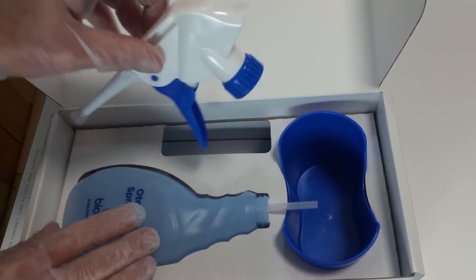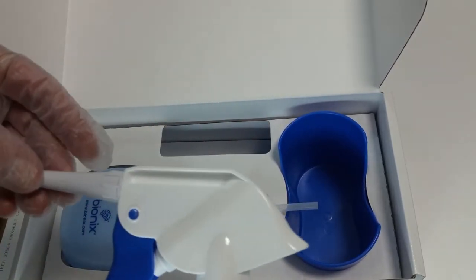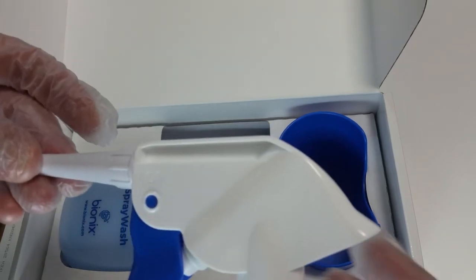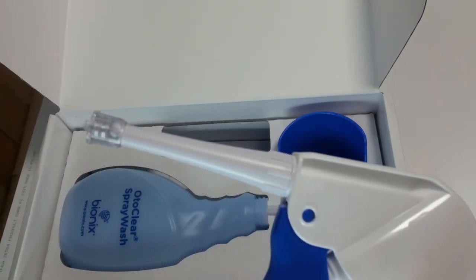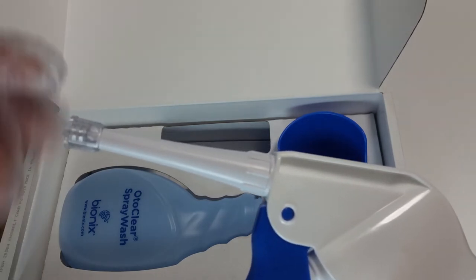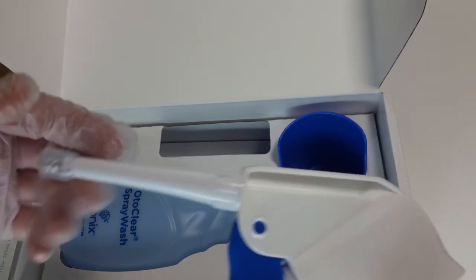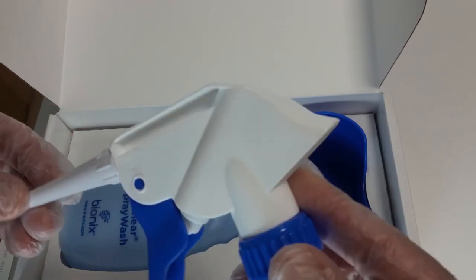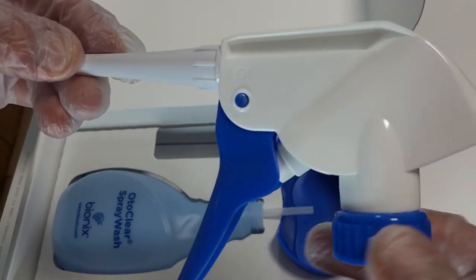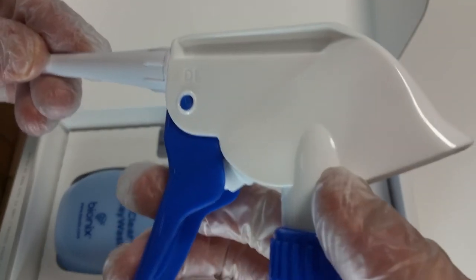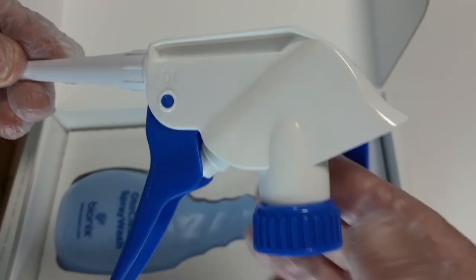This is the spray wash head. It seems fairly sturdy. At the end, this is where you screw the tips on. And that's for screwing the head onto the bottle and the pump handle.